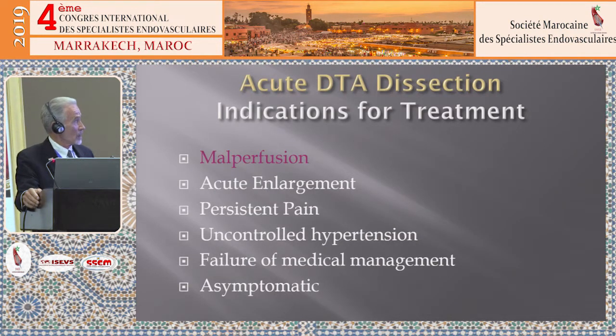dilatation. So the first group that was looked at were patients that had dissections with malperfusion. Everybody agreed in this case that these were not good surgical candidates. Most of the time they have very high paraplegia rates and complications, and obviously you can't treat them with medical therapy, so this was a good place to look at the endografts.